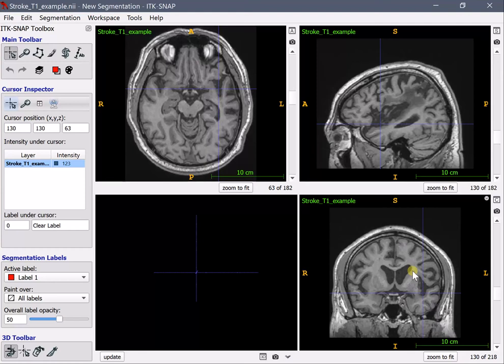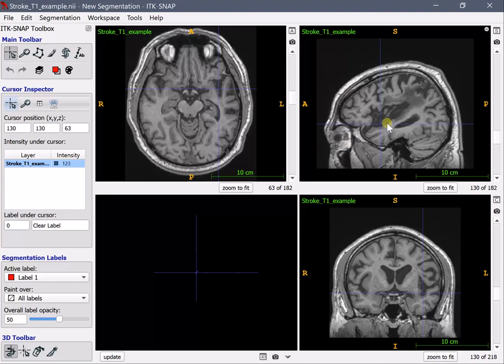Now note I'm not an expert lesion segmentator. I'm not an expert rater of the lesions but I just want to show you how quickly lesions can be drawn in ITK snap.